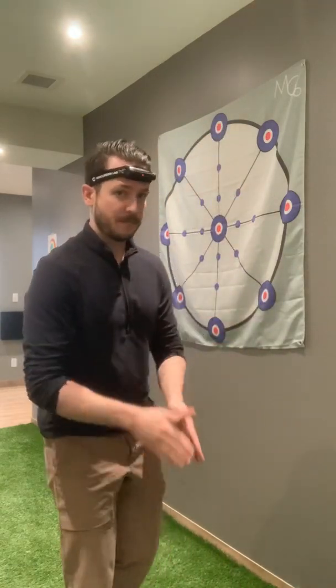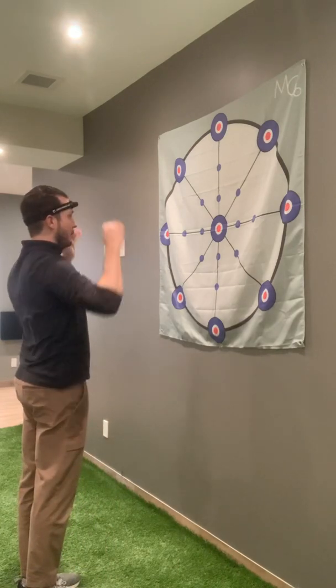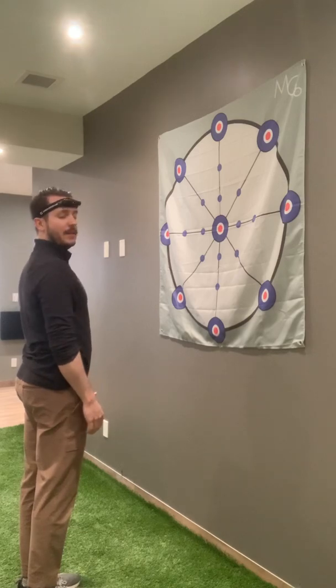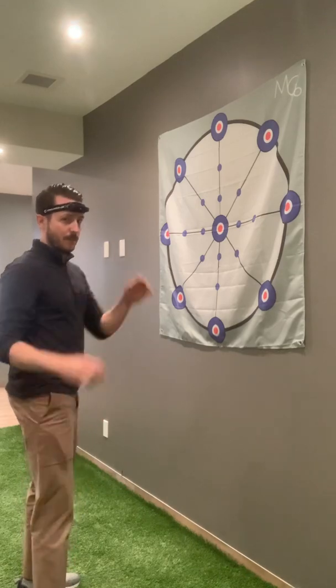To start, let's go feet together with the laser on the middle of the target — this can be a picture or an X on the wall. Close your eyes, turn your head to the right, come back to the middle, and see how close you are to the middle of the target. So it looks like this: laser on the target, close your eyes, rotate, come back to the middle, and see how far off you are.